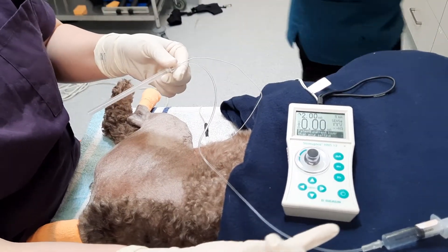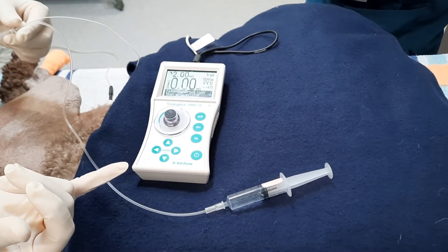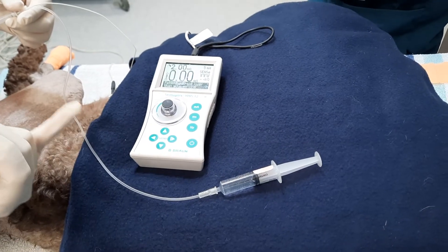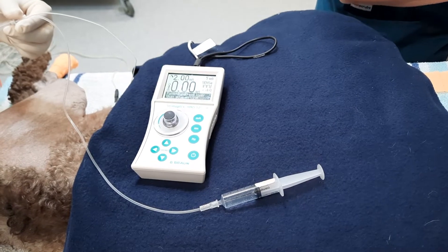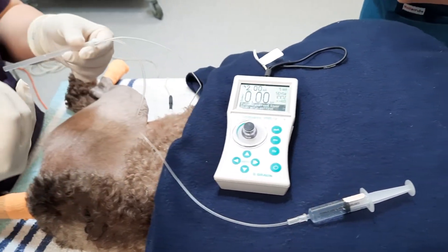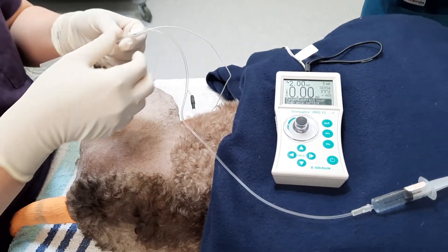First I'll talk about the local anesthesia that we use. It is 2 mg/kg of lidocaine and 2 mg/kg of mepivacaine and saline in a 1:1:1 ratio. This will be divided between the sciatic nerve site and also the femoral nerve site.